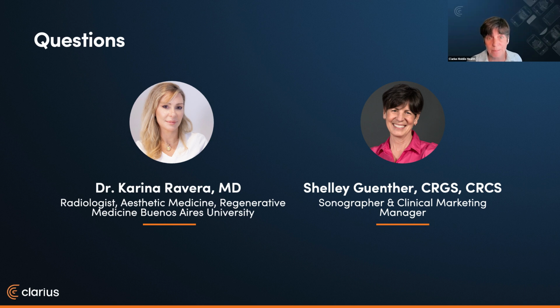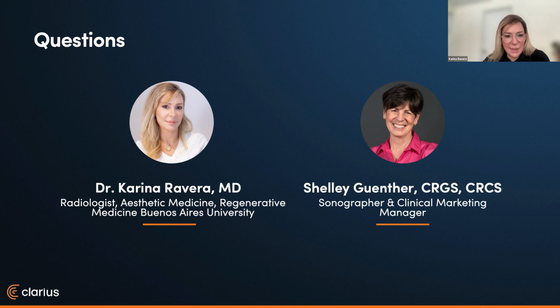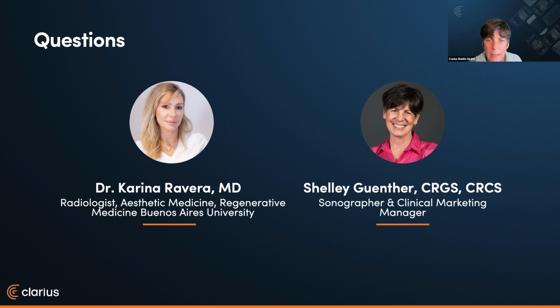It can really help with longer scanning times. I cannot understand this question from Dr. Sean Van de Putte. I switched from phone to PC regarding my question about the reference. We can write a message. Yeah. Well, if we didn't get to all of the questions, we'll definitely follow up with an email afterwards, either myself if it's a technical Clarius question, or Dr. Ravera if it's something a little bit more clinical.